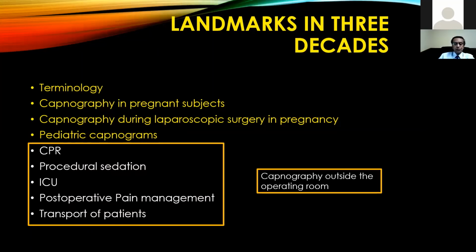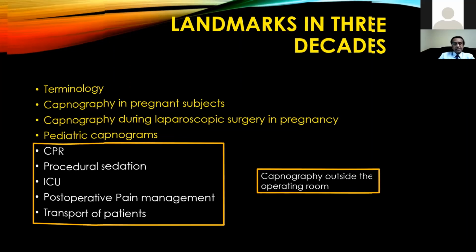So they are taking full advantage of capnography, not only during intubation, but also during transport to the emergency departments and other institutions. So these are the various landmarks that have occurred in capnography in the last 3 decades.